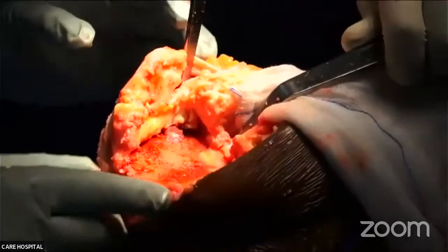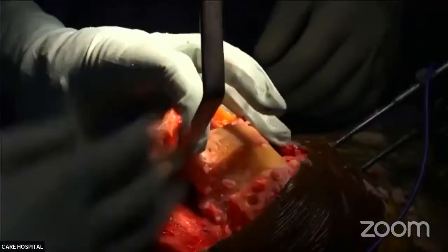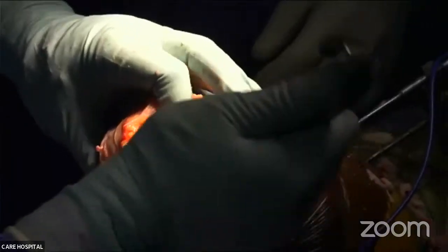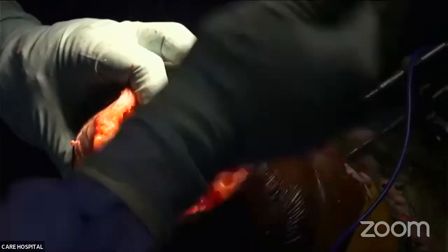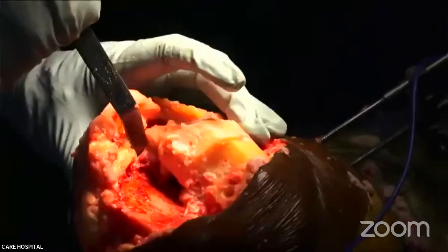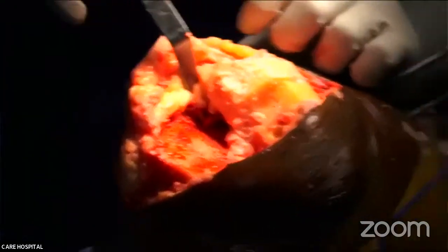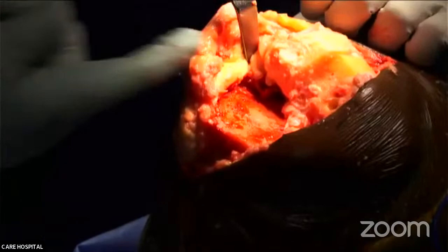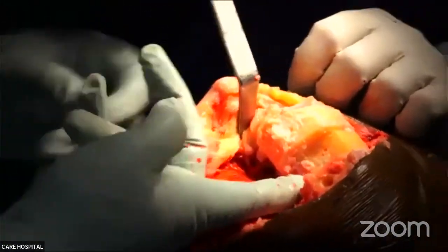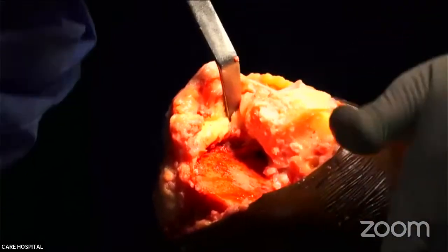Osteotomy hammer. Remove the posterior osteophytes. So there are posterior osteophytes present in the femur.